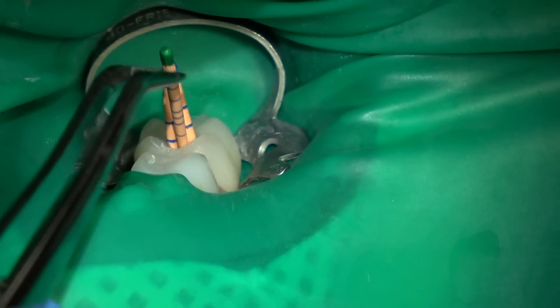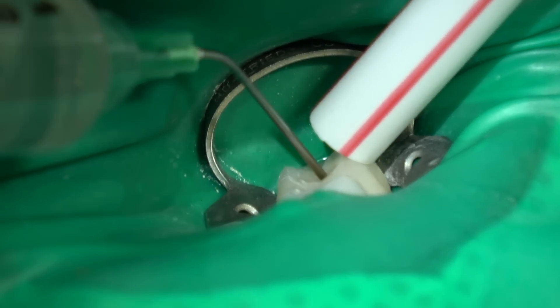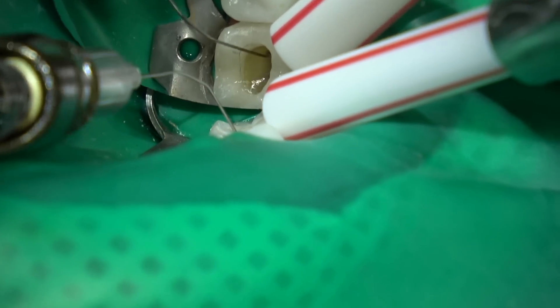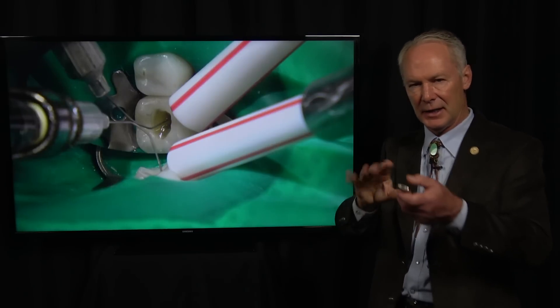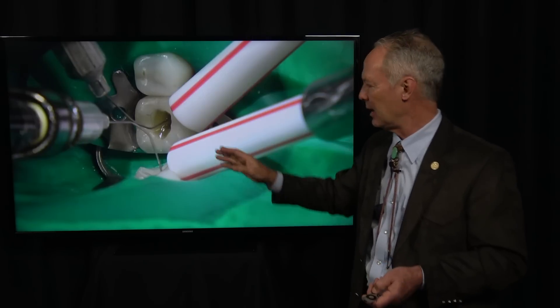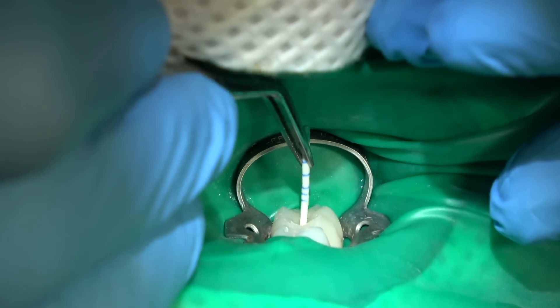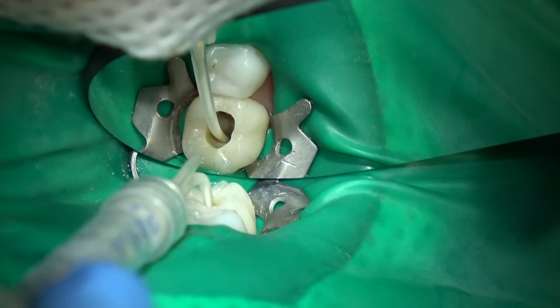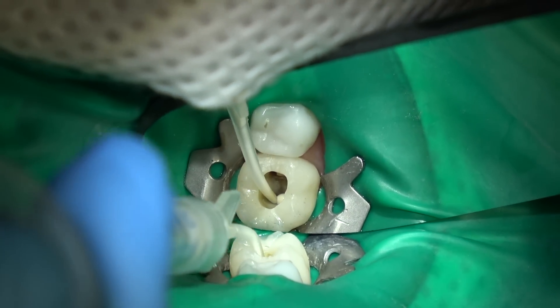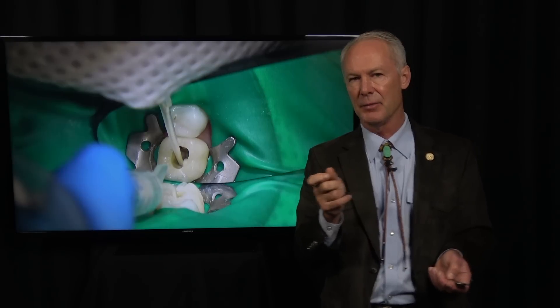Now I'm going to place my gutta-percha cones in the canals and take a radiograph to confirm the length is correct. Looks good — this one's just a little bit long, so I'll measure and cut it. Then I'm going to irrigate again with Citanest plain using a 30-gauge local anesthetic syringe, rinsing out the dilute sodium hypochlorite and any tooth dust so there's nothing but clear liquid coming out of the canal. Then dry them with paper points — two paper points in each canal. This is BC Sealer, and I'm going to squirt that under a little bit of pressure into each canal. Just squirt it in and lift it out so you don't incorporate air bubbles into the sealer.